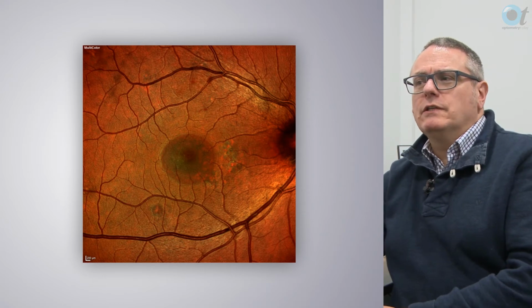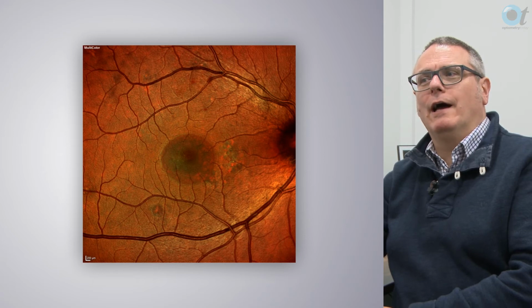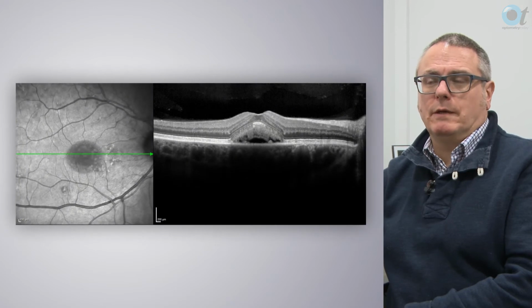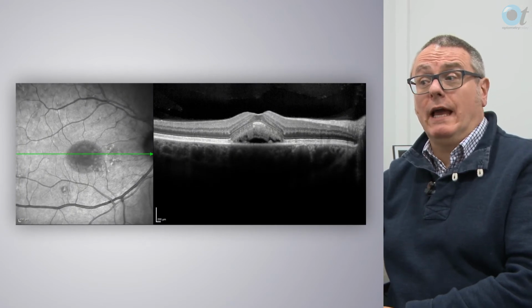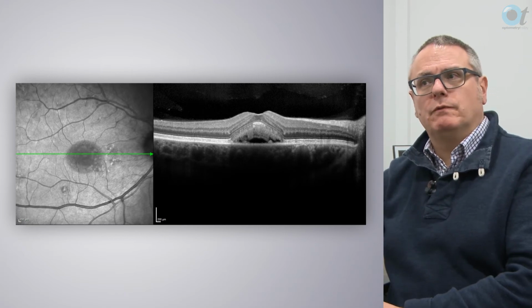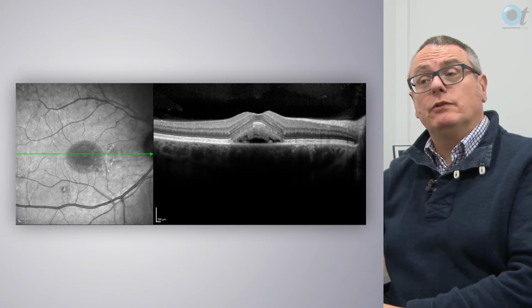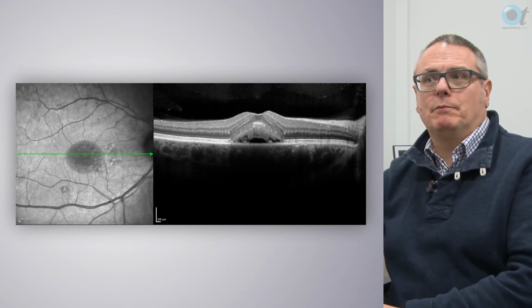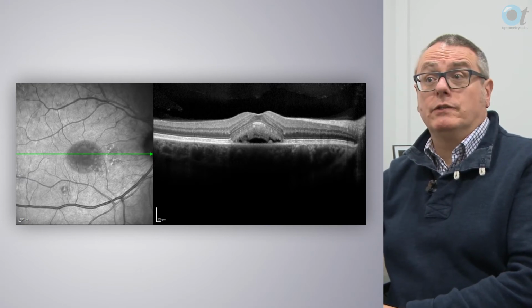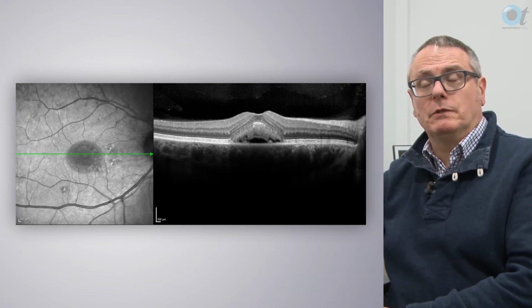Now, is there any evidence that this is perhaps an acutely noticed problem, and not actually a genuinely acute presentation? If we look at the outer segments of the photoreceptors, they seem to be thickened and enlarged. And when we're thinking about normal photoreceptor physiology, the outer segments are shed and normally phagocytosed by the RPE. If the neurosensory retina is detached from the RPE, then that process cannot normally take place. So this area becomes infiltrated with macrophages, which try to absorb this waste photoreceptor material.